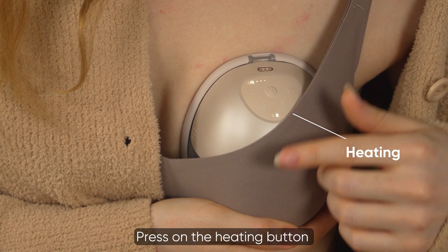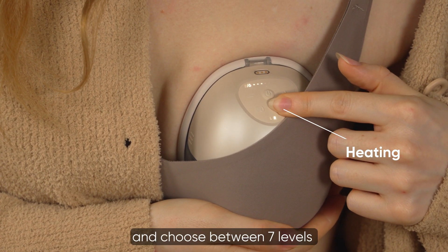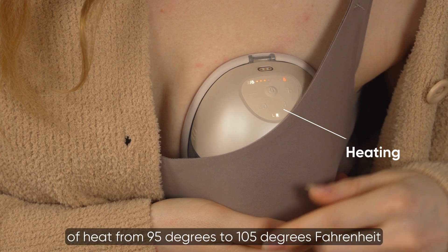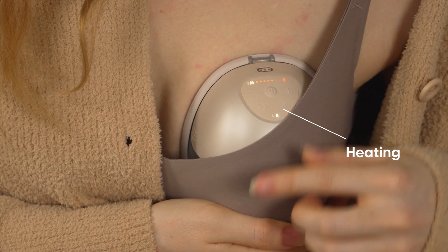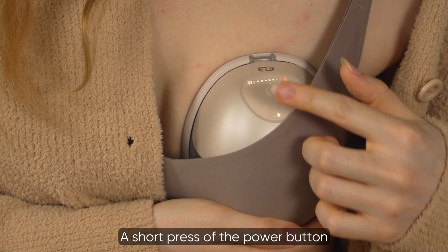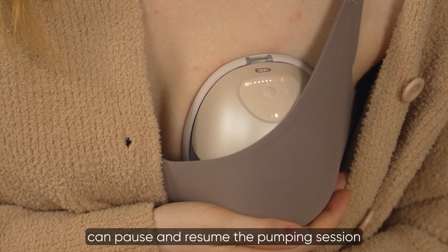Press the heating button to start the heat flow experience and choose between seven levels of heat from 95 degrees to 105 degrees Fahrenheit. A short press of the power button can pause and resume the pumping session.